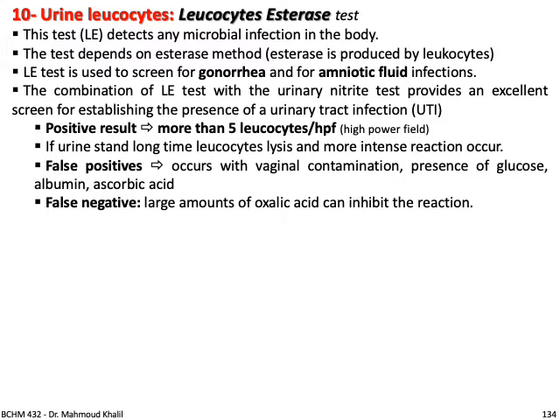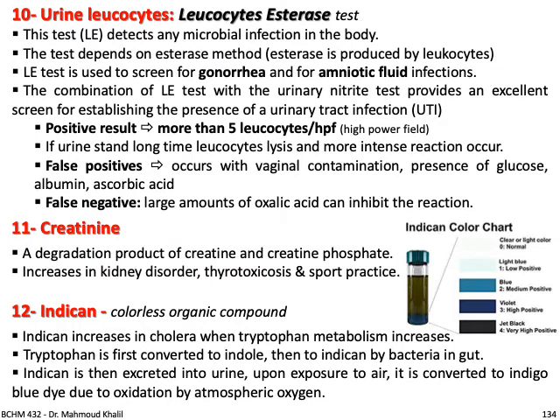If urine stands a long time, leukocytes will lyse and a more intense reaction occurs. A false positive occurs with vaginal contamination, or the presence of glucose, albumin, or ascorbic acid, vitamin C. A false negative is due to a large amount of oxalic acid, which can inhibit the reaction of the esterase.